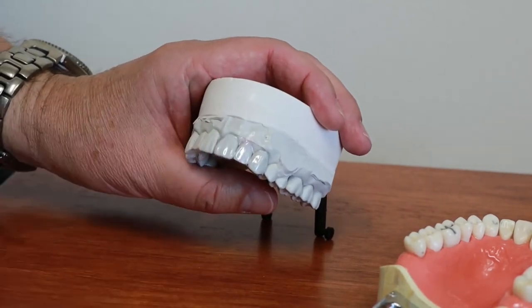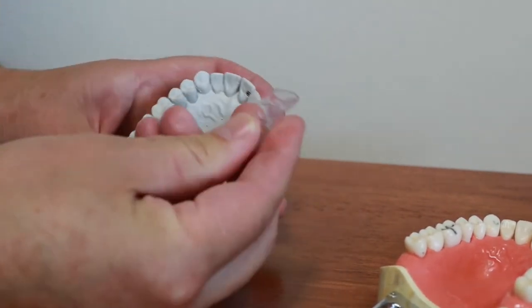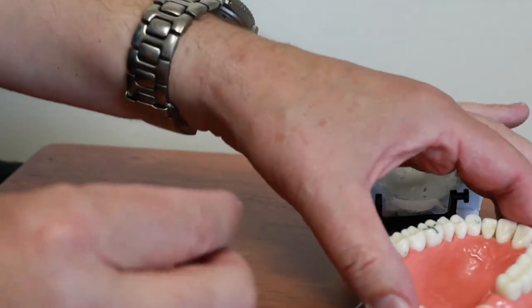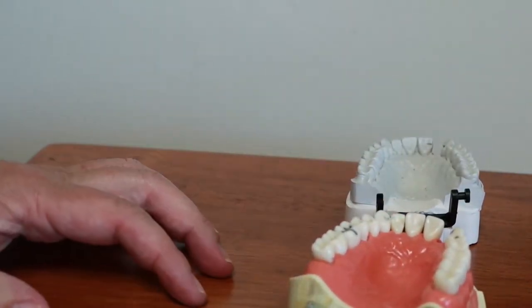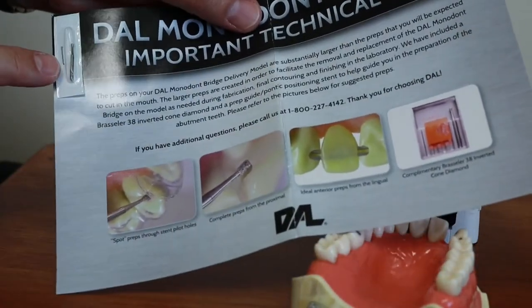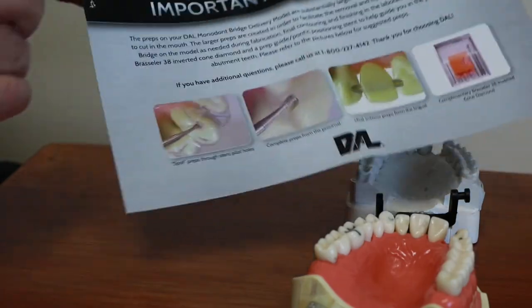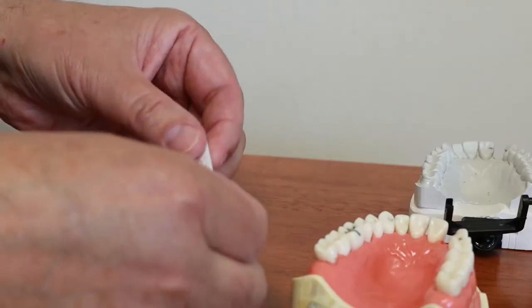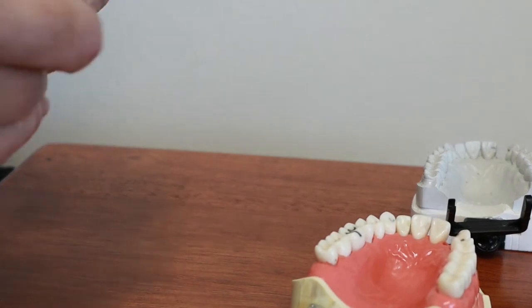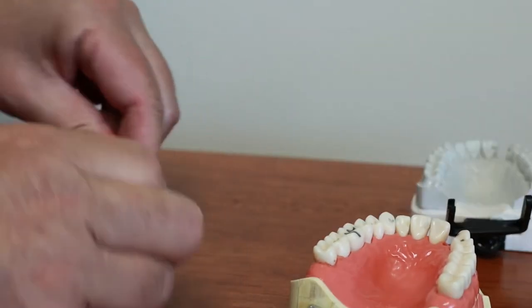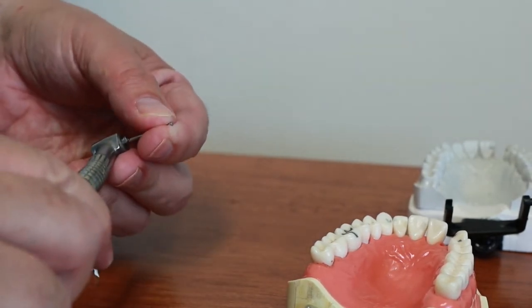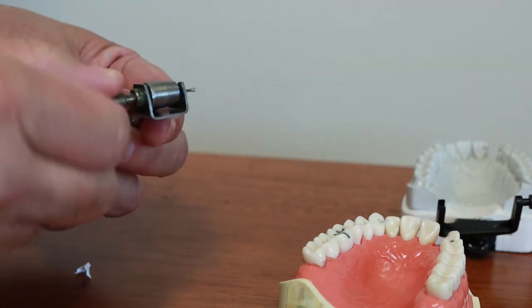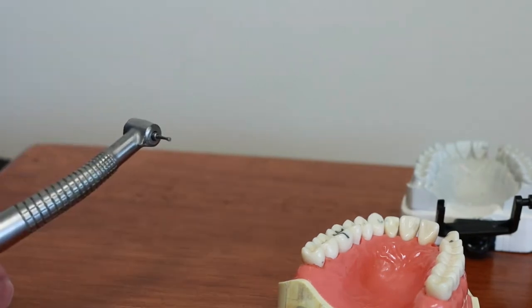I got the Maryland bridge back from the lab. It includes this handy dandy little prep guide and the bridge itself. And in addition to the bridge and the prep guide it also included a special burr, an inverted cone diamond that Dental Arts Lab recommends we use to make the preps for the bridge. Let me put the burr in my hand piece. Just using an air driven hand piece.